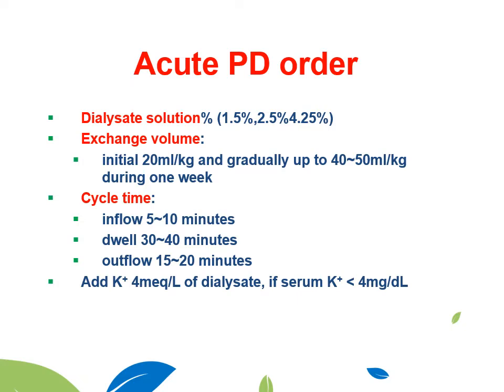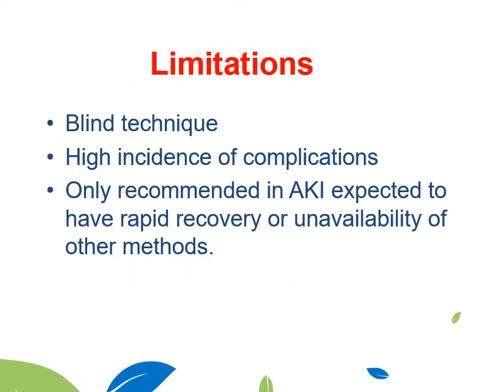The cycle time can be almost 1 hour: 5 to 10 minutes for the inflow, 30 to 40 minutes for dwell time, and outflow in 15 to 20 minutes. Meanwhile, you should keep an eye on the serum potassium of the patient, and it should be supplemented most of the time due to the frequency of hypokalemia that occurs.